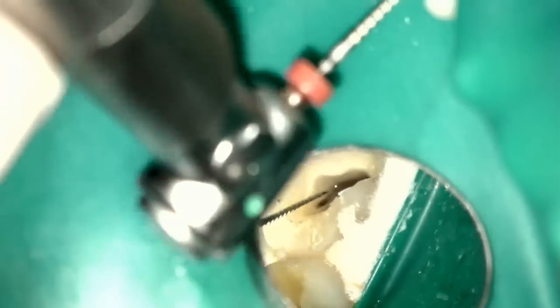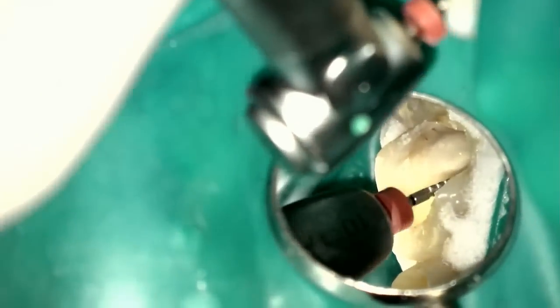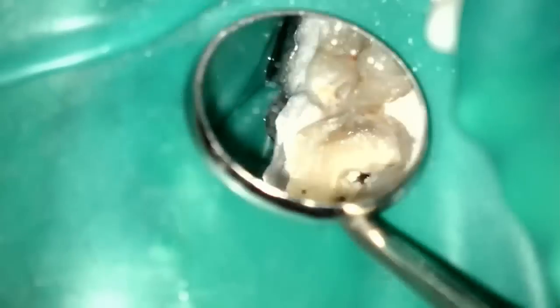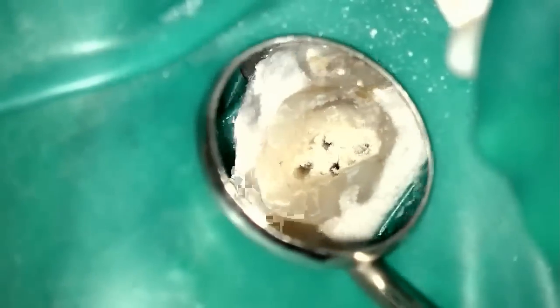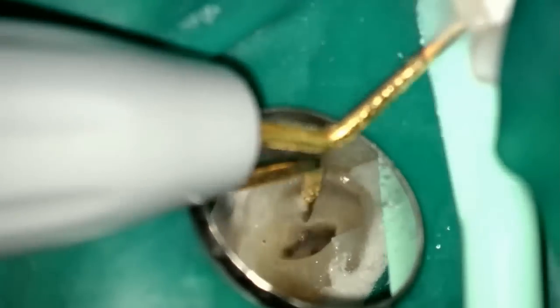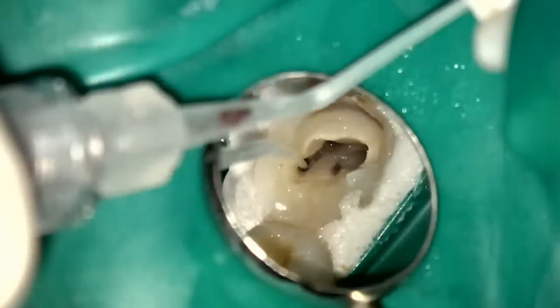Here we are with the red profile. Note this filming is at double speed, so I'm not actually working this quickly — it helps make the video footage a little shorter. The initial access is pretty much done. We've opened up the coronal third a little bit. Here I go with a number two Gates, then a number three Gates, and we do a little brushing with the number four Gates in the very coronal portion. You get a lot of dentin debris up in the canal chamber, which I'll rinse out with sodium hypochlorite. The whole time I'm pushing these against the outer wall so as not to get into the furcation. I'll use an ultrasonic just to refine those vertical walls a bit, and we come back and suction it out.